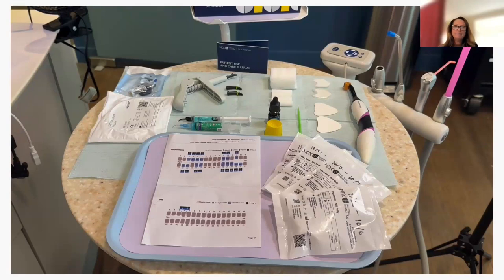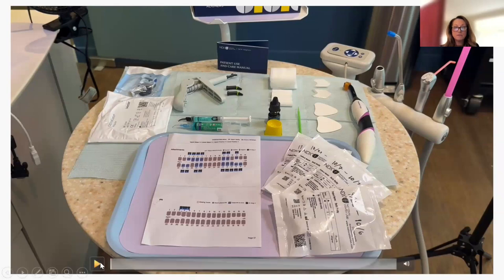If you had an ortho box, you can put it in something that blocks the light so it doesn't cure while you're etching and placing the bond. And you can add attachments to a crown, but you're going to have to use your porcelain etch.